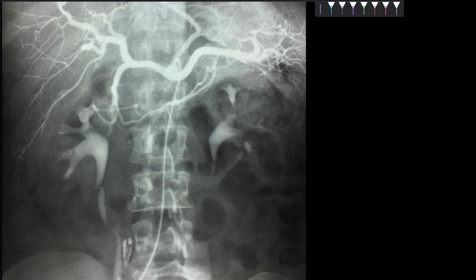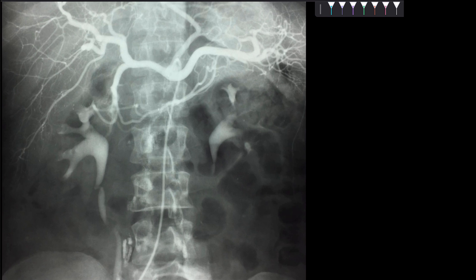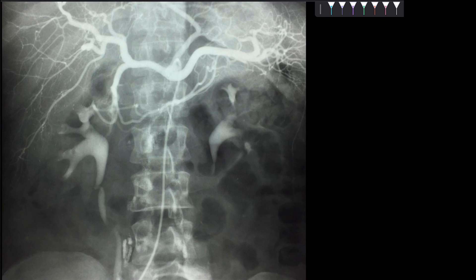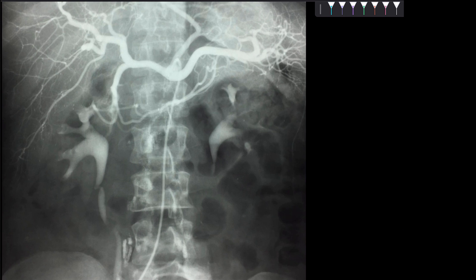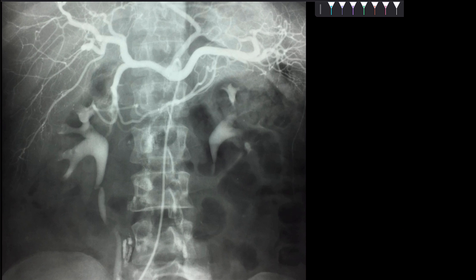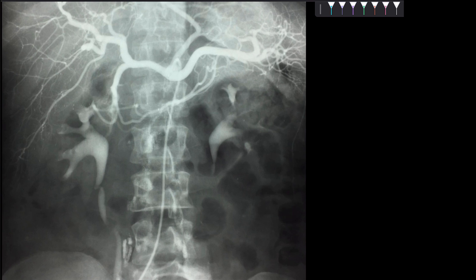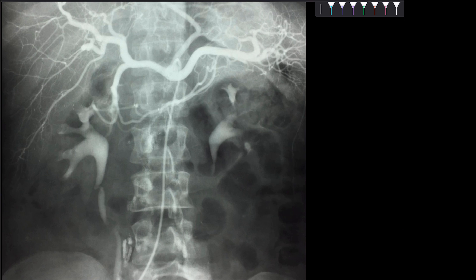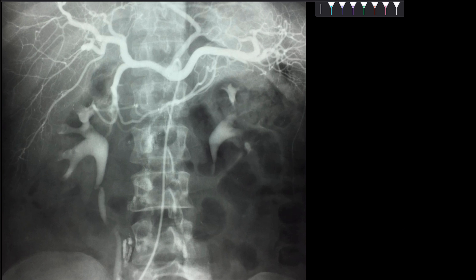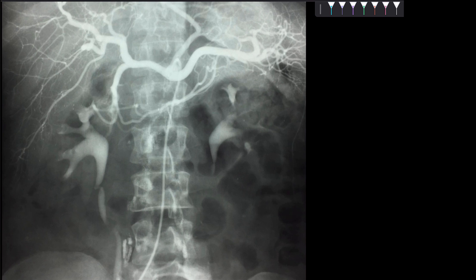We are learning about a very special type of diagnostic image that highlights the vessels, called an angiogram, and this procedure is called angiography. We insert a catheter that goes to our required vessel under fluoroscopic guidance, and then we inject a contrast material so we can highlight the whole arterial tree to look into any pathology or obstructive disease.